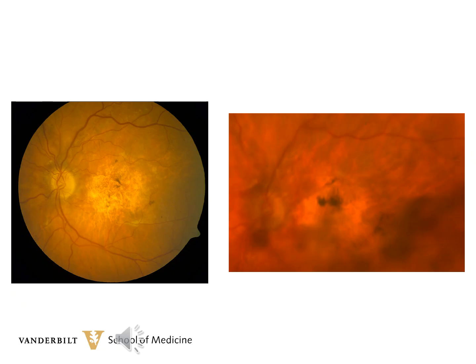Eight years later, the vision had dropped and was recorded as 20/200, but she also had a moderate nuclear cataract. And then you can also see some more pigment clumping and migration in the central macula.